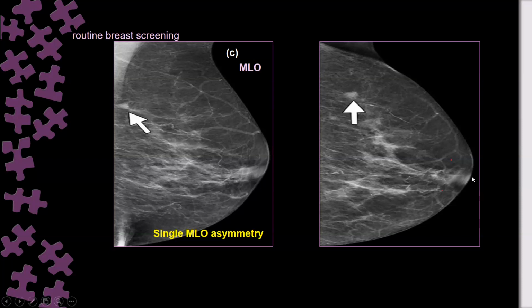No. This is a nipple. This is a posterior nipple line. Compare the medial portion in relation to the lateral portion. The lateral portion included here is almost double the distance of the medial. And you can see here even the axillary fold. Can you see? Yes. This is an extended lateral view.